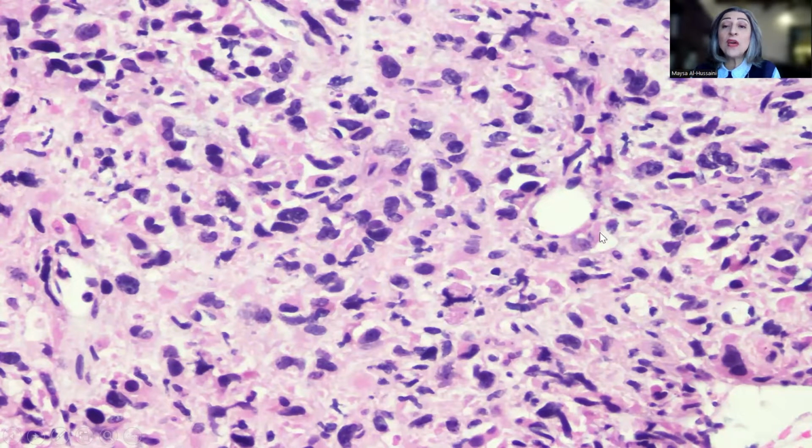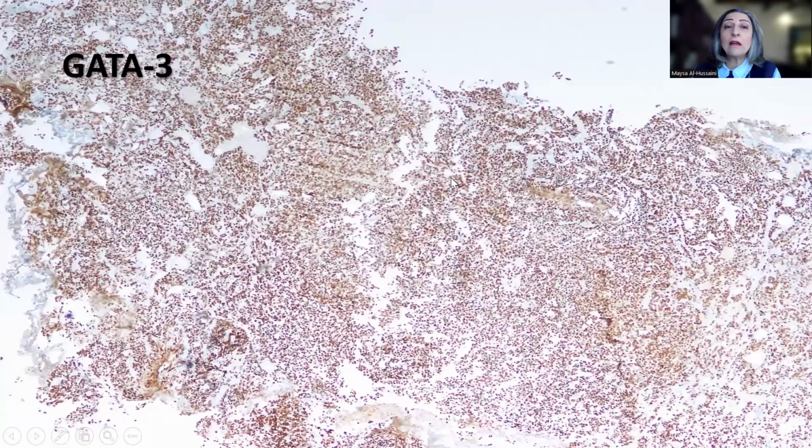To me, this is very much reminiscent, actually, of lobular breast carcinoma, in particular, the pleomorphic lobular breast carcinoma. And this is one important differential diagnosis that we should keep in mind whenever we encounter such discohesive tumor cells infiltrating through the biopsy fragments in urothelial carcinoma.